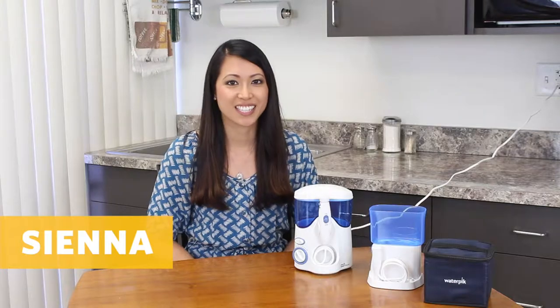Hi, it's Sienna from Curious Chicks and today I'm doing a product review. This is called the Ultra Water Flosser by Waterpik.